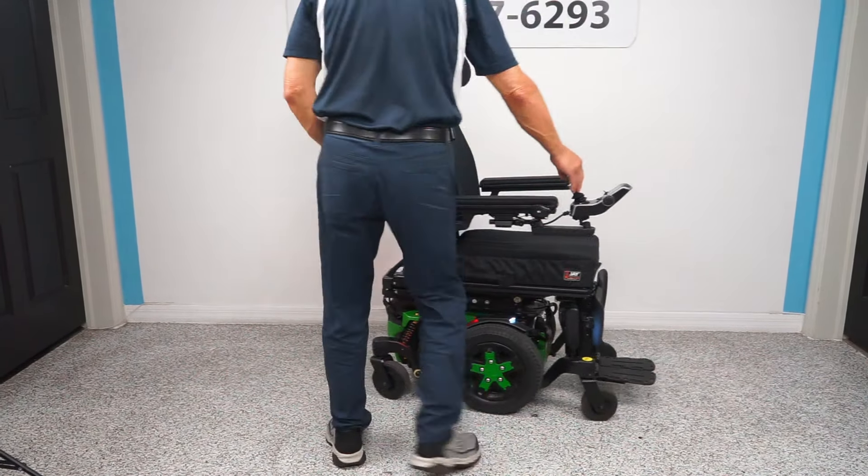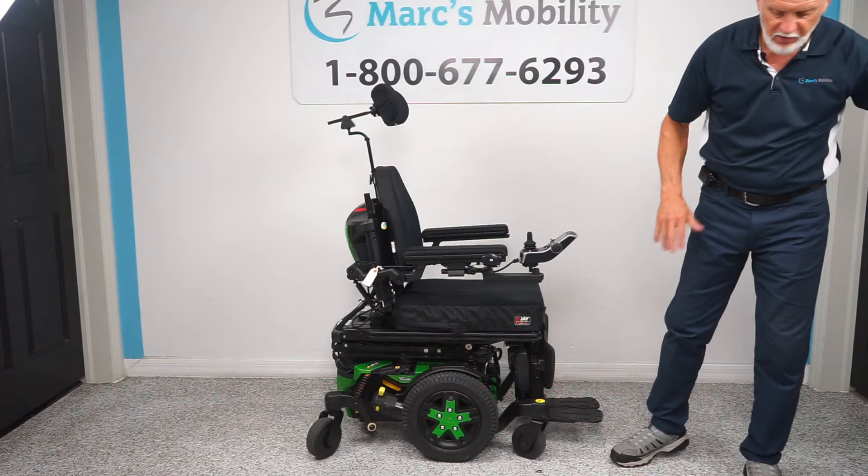The headrest is fully adjustable — as you can see it's contoured, with adjustments back and forth, up and down — fully adjustable and removable. When you go to charge this chair, take your charger and plug it in here. As soon as the light goes green, the charger will stop charging when the batteries are full.